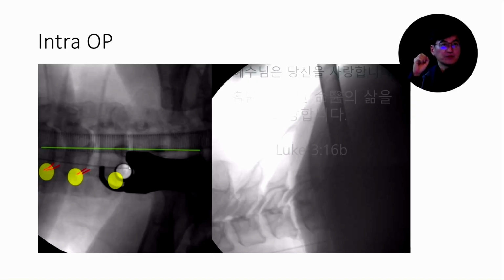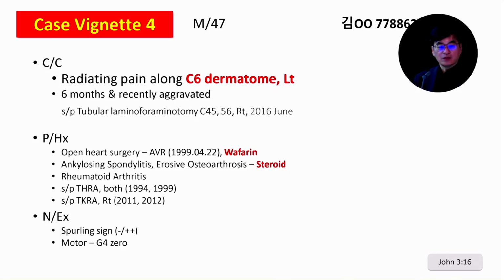Remember, the endoscope has optics, right? 15 degree, 20 degree, and 25 degree. Placing this endoscope in that manner, you are not able to reach the lateral side, right? Very challenging. So that is why I made an incomplete decompression. Eventually, this patient got an ACDF 2 months later.